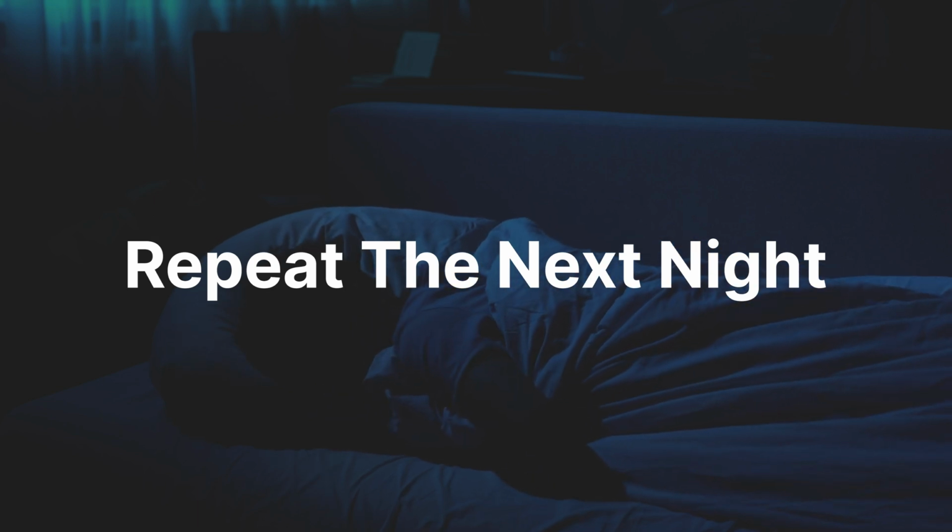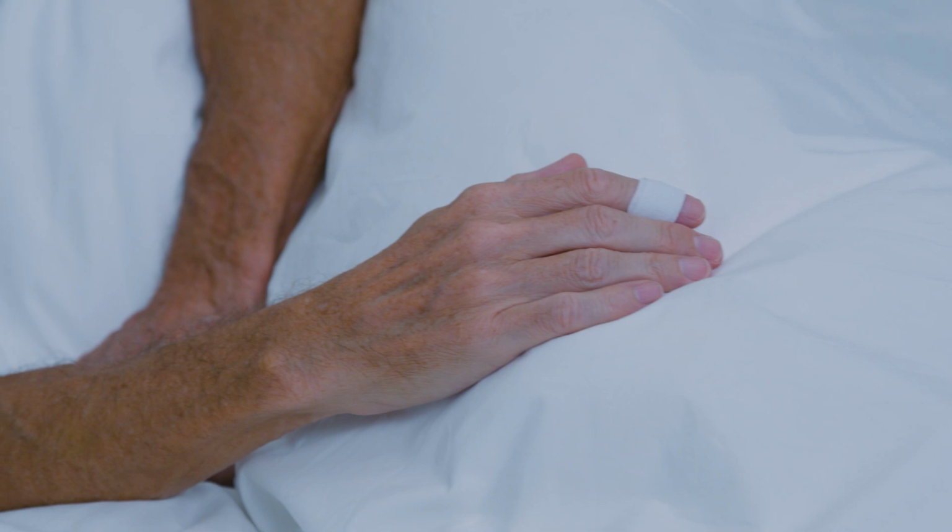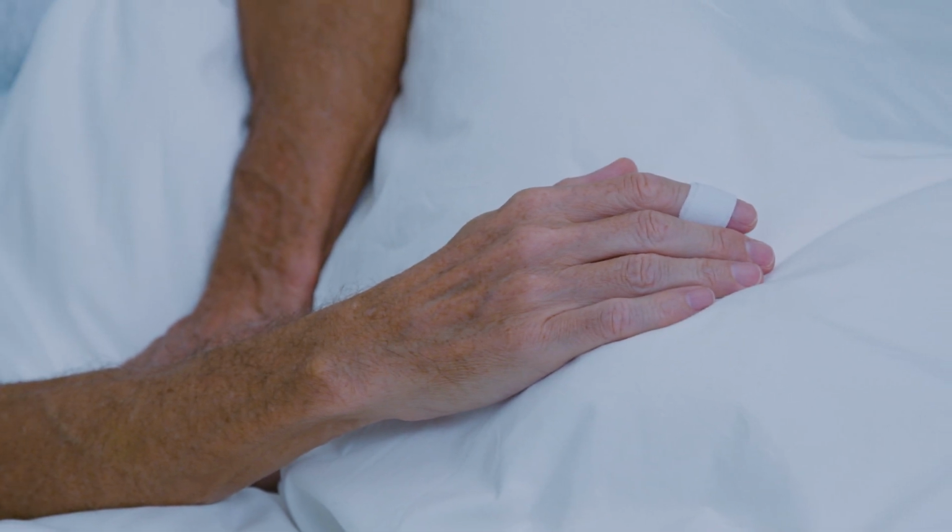Step 6. Repeat the next night. Your sleep test includes 2 nights, so just repeat the exact same process the next evening. Why 2 nights? Well, multiple nights of testing leads to more accurate results for us. If we ever need more nights for a clearer picture, don't worry, we'll let you know by text or email.